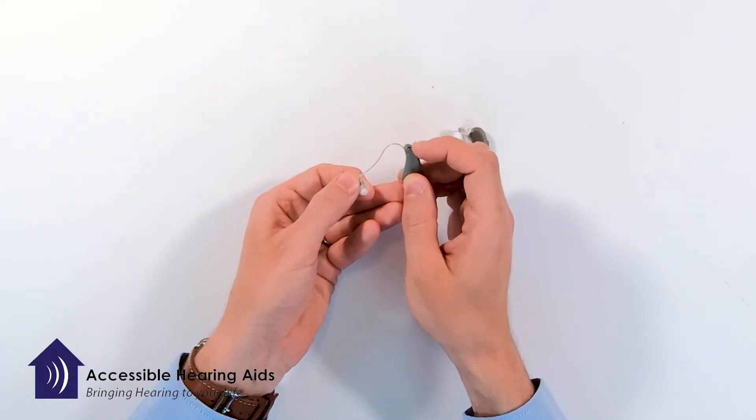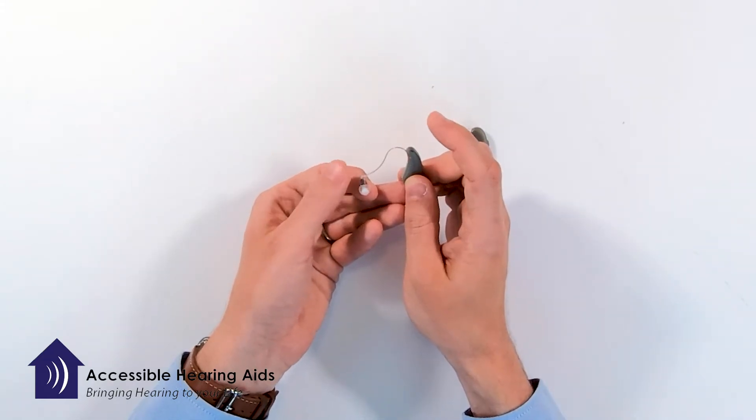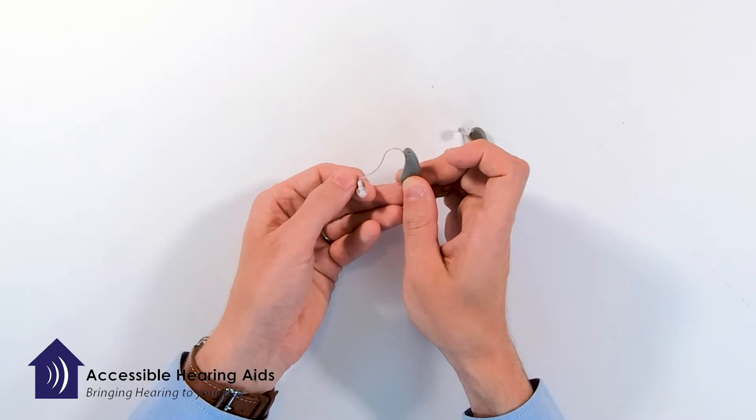You want to put the body of the hearing device right on the top or behind the ear and then let that wire wrap around the front and then insert the dome as deeply into your ear as possible.